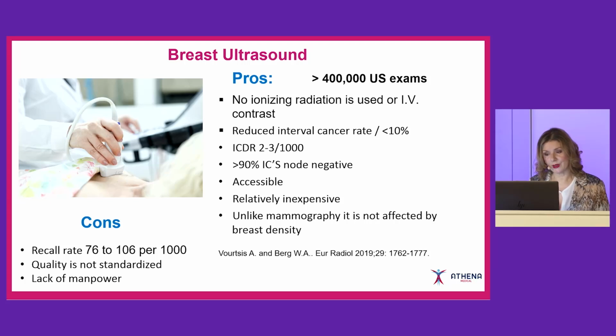So the next day she went to her surgeon. Her mammogram was interpreted by me as negative, and the surgeon came in complaining that there was a palpable lump that was suspicious for malignancy. He had performed fine needle aspiration biopsy, and it was a cancer. So we took the patient together to the ultrasound department, and we checked the area of concern, and we saw that there was a cancer.